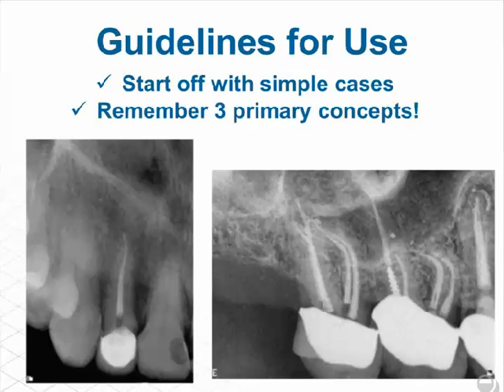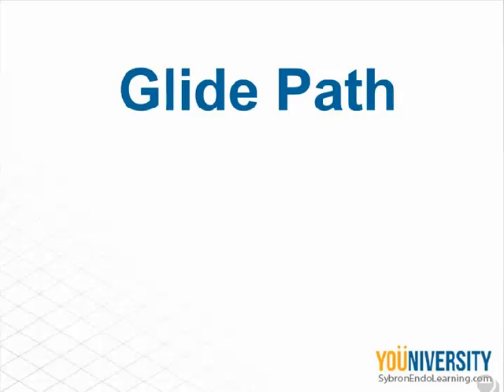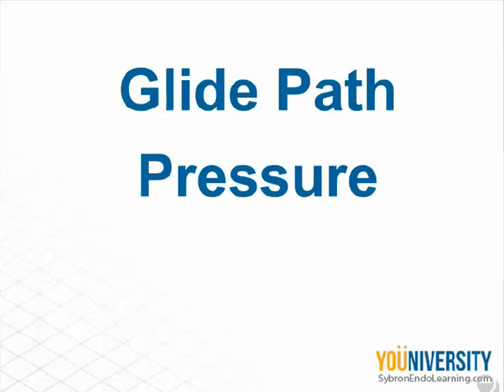And remember, 3 primary concepts. With any nickel titanium system, create a glide path. Apply no more pressure than that which would break a sharp lead pencil, and limit the amount of time in the root canal. You're in, you're out. You engage, you remove the file, you wipe off the debris, and then you reinsert it.